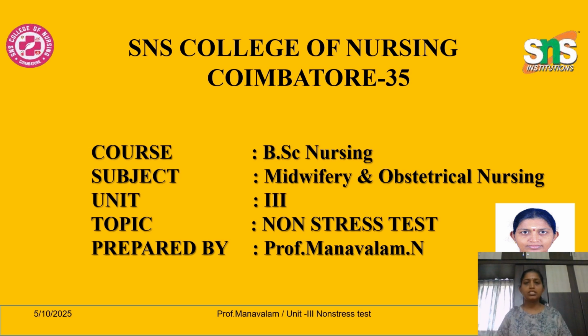Today we are going to see about the non-stress test. It is one type of non-invasive method of diagnosing fetal well-being, and also we can diagnose fetal problems early by doing this test.